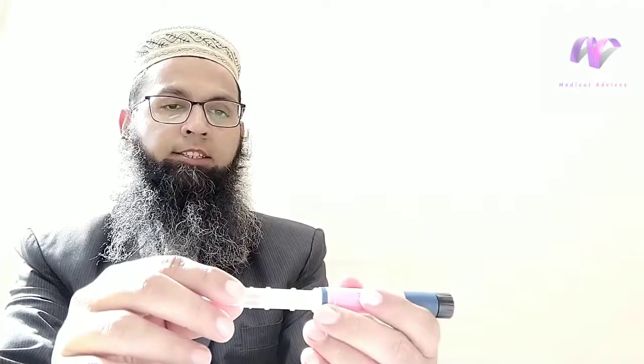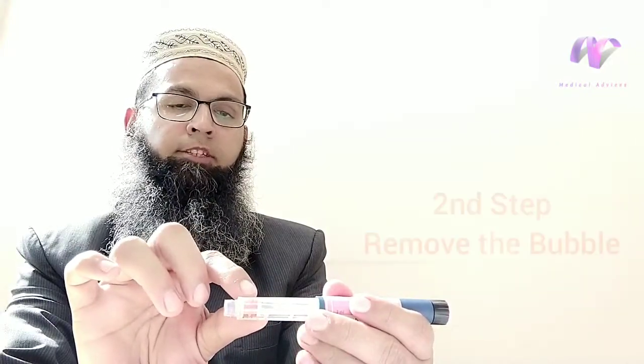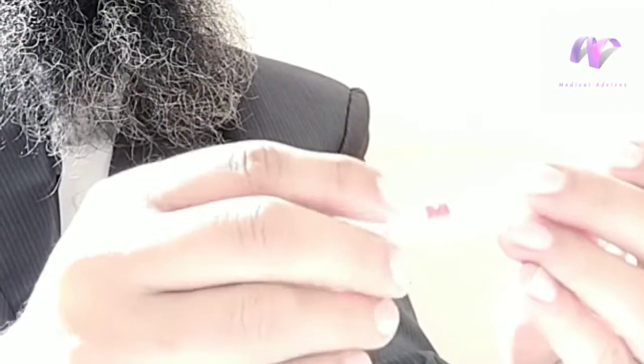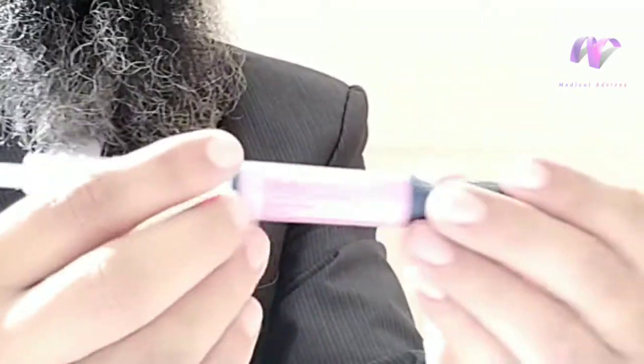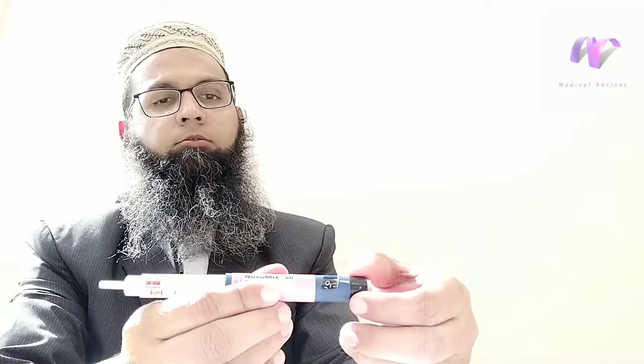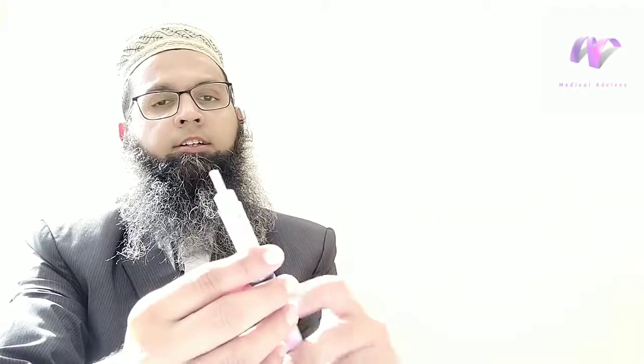And then after you have done this, you first need to remove any bubble present in the calibration unit. So in order to make sure, you first need to mount this insulin needle. Once you mount the insulin needle, you can load 2 units by rotating this dialer. After you rotate this for 2 units, you just press it in order to make sure that the insulin is coming out. You first need to remove this cap in order to make sure that the insulin is coming out, so that there are no bubbles present in it. So once you prime your device, you are ready to administer.